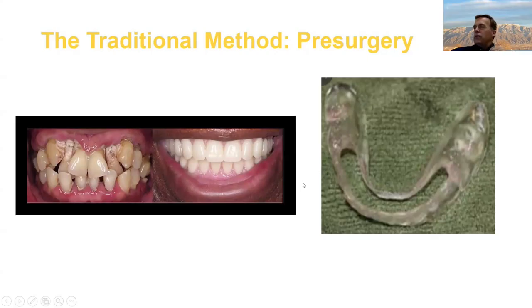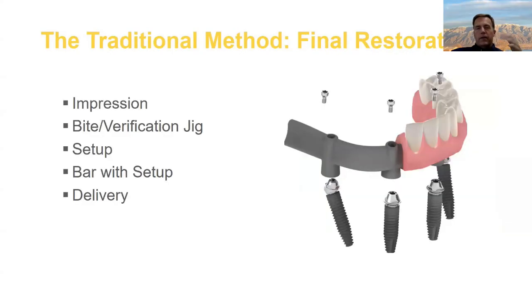So the surgeon reflects the tissue, extracts the teeth, does the alveoplasty, places the implants, places MUA abutments, and then sutures. Usually temp cylinders are put on the MUA abutments, holes are punched in the denture, it is connected to those temp cylinders, and all the flanges are cut off, and that becomes the screw-retained provisional the patient wears. Again, there are ways that are a lot easier than that. If any of you have ever done that before, it's a project. But anyhow, that's the overview of what happens on the day of surgery.